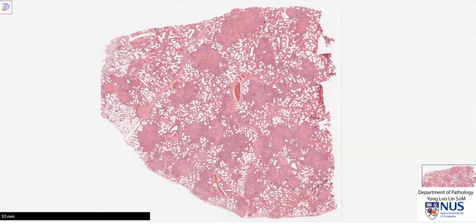Miliary TB typically arises due to hematogenous spread, with the bacteria being seeded into the venous circulation. Hence, we get multiple areas of infection, and many of these actually coalesce. You can see the pink necrotic areas in the center of the granulomas coalescing to form a larger area of necrotizing granulomatous inflammation.